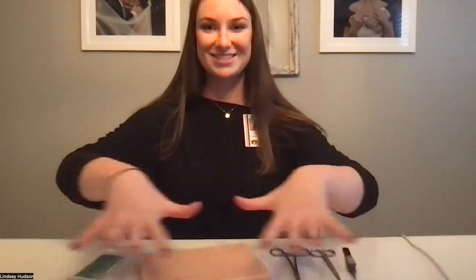So now we're going to set up our sterile field. We're going to take off those gloves that we've used, wash our hands again. We're going to don some sterile gloves and create a sterile field, this is our sterile field. And then we're just going to get ready for the suture process.